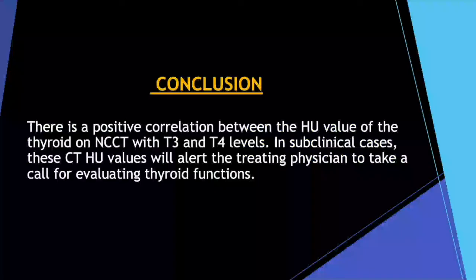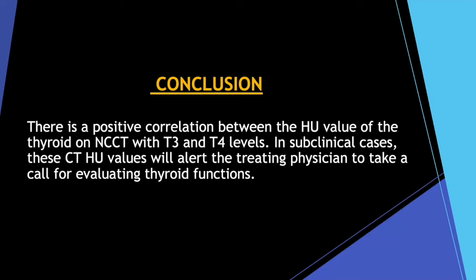In conclusion, there is a positive correlation with T3, T4 levels and a negative correlation with TSH levels of the HU value of the thyroid gland on a plain CT. In subclinical cases, these CT HU values will alert the treating physician to take a call on evaluating thyroid functions.